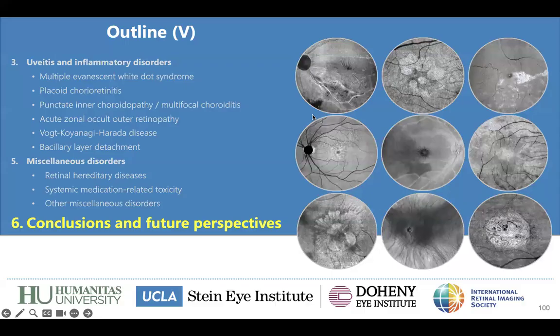Yes. Thanks, Murilo, for this suggestion. Let's do an ultra-widefield OCT, retina and orbit atlas. Let's do it. For the hardware or software, I don't have much experience, honestly. I think it depends a lot on the device. I have no financial disclosure, but I'm not sure if I can mention anything.